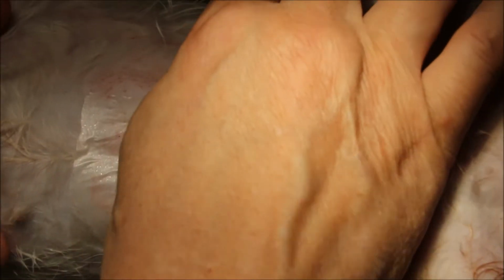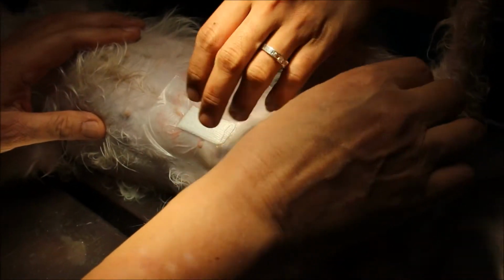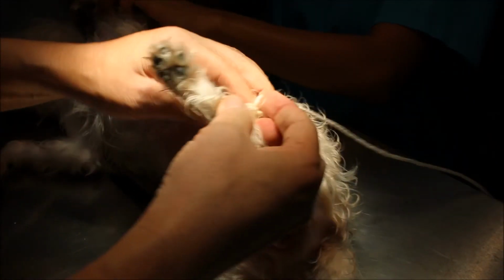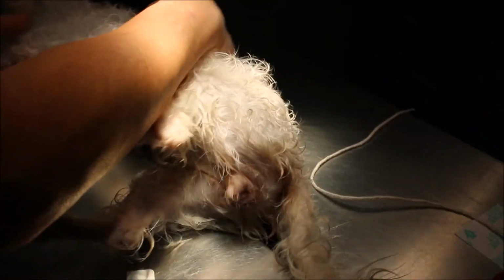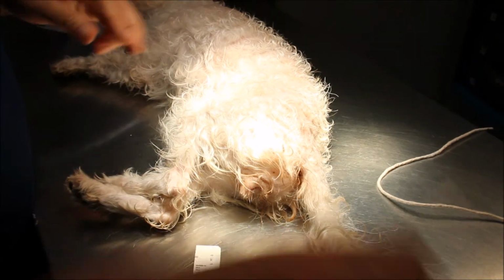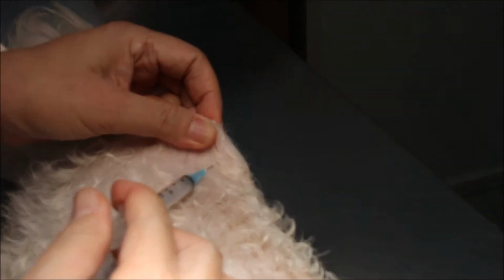Okay, now I'm going to give the antidote. This dog was given Domitor plus ketamine IV for sedation, and now I will wake her up by giving the antidote called Antisedan. Now she's not fully awake yet, so the Antisedan will reverse it. Before that, I'll give the painkiller and antibiotics, which is Baytril plus painkiller subcutaneously, so that there is no pain. This is a standard procedure in Toa Payoh Vets.